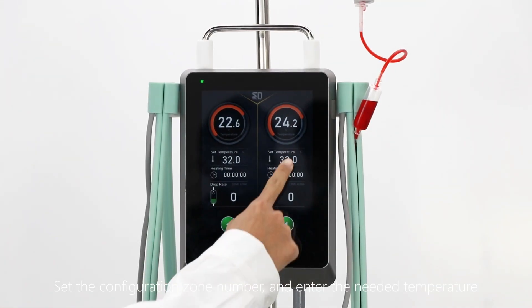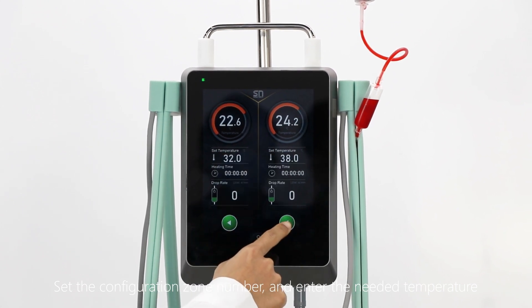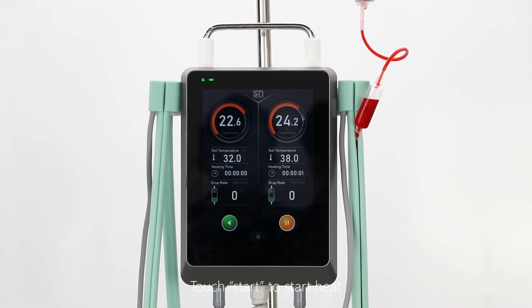Set the configuration zone number and enter the needed temperature. Touch start to begin heating.